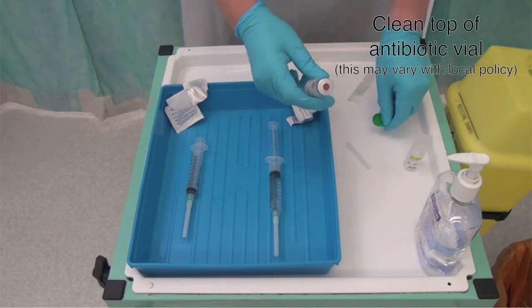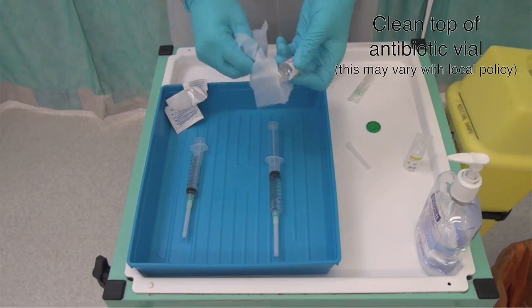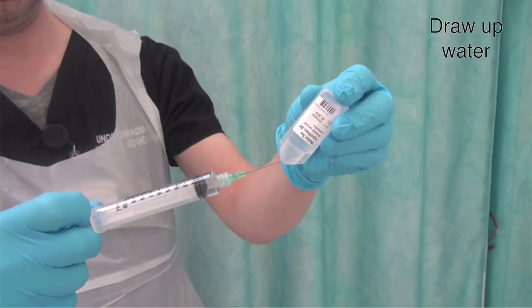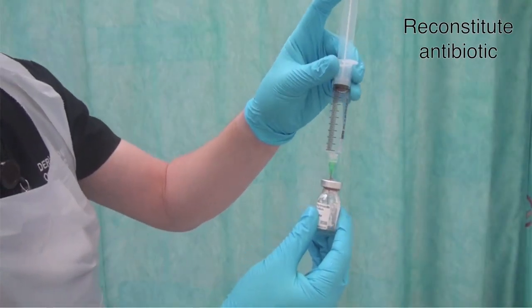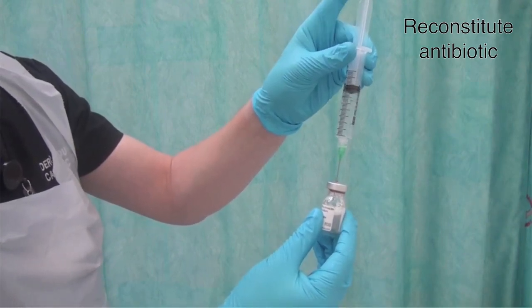Remove the cap off the antibiotic and clean the top thoroughly using a wipe. Draw up your water to reconstitute the antibiotic. Using the same needle, inject about 5 mls into the antibiotic vial, then release the pressure by releasing the plunger and allowing the air out.